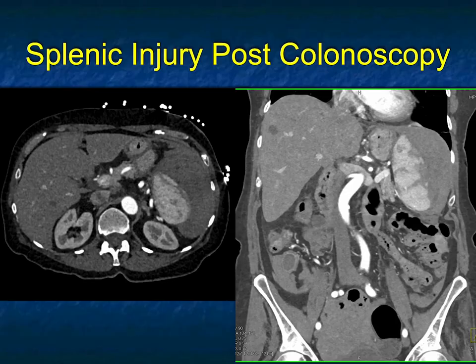And so in this case, when I ask you the diagnosis, it's going to be splenic injury post-colonoscopy. An unusual complication, but if a patient comes to you post-colonoscopy with pain, you've got to be thinking of colon perforation, bleeding, particularly if the patient had a biopsy or a polyp removed or something like that, or laser, or the patient just simply had injury to the spleen.